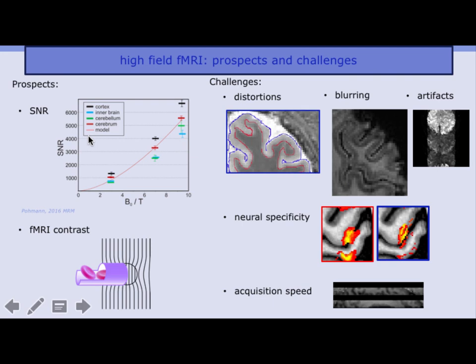With respect to whether the higher field strength has some conceptual limits in temporal resolution, I'm not sure. We are doing vascular-based fMRI. We are mostly limited by the physiological hemodynamic response function in terms of resolution. So the higher resolution people usually go for at high field strength or with advanced acceleration is usually not really to sample the neuroactivity faster, but to get rid of unwanted stuff, like for example cardiac-induced or physiological noise that you can filter out more easily.